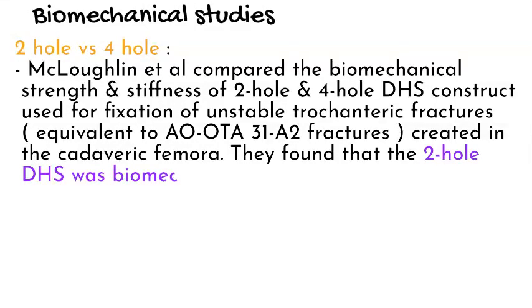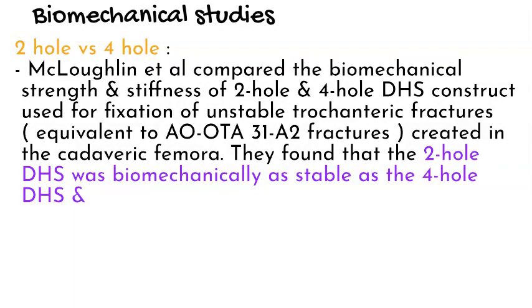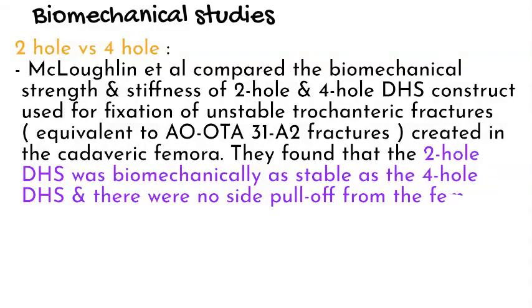They found that the 2-hole DHS was biomechanically as stable as the 4-hole DHS, and there were no side pull-off from the femoral shaft.